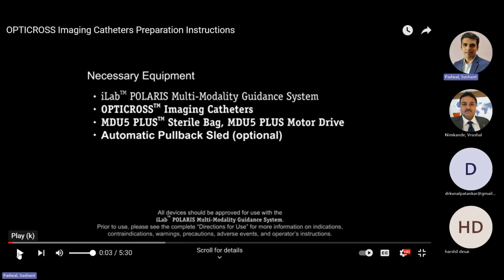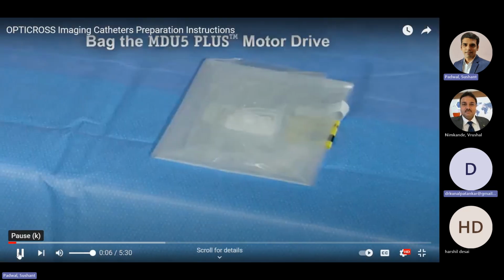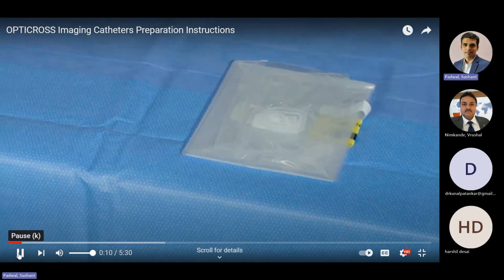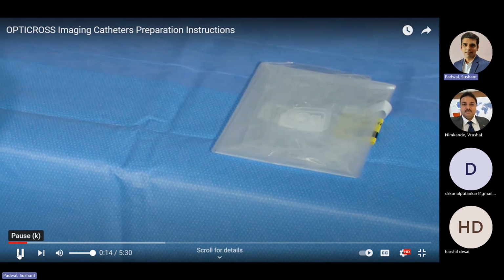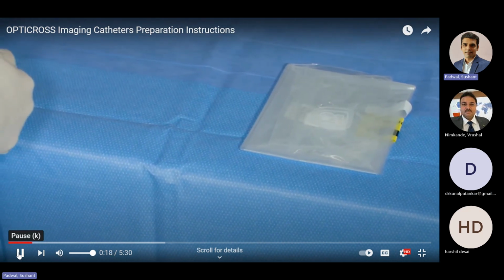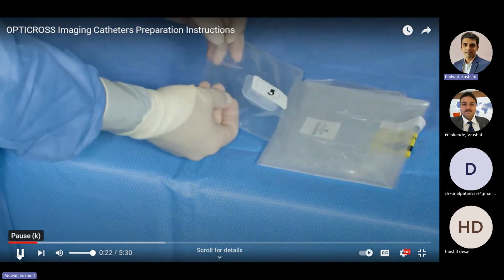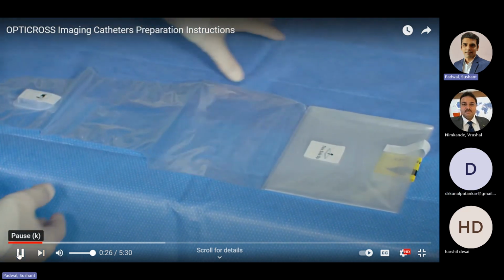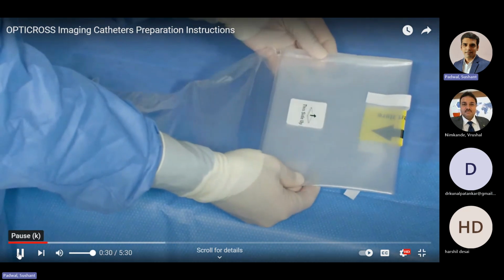To bag the MDU5 Plus motor drive, one sterile field operator and one non-sterile field operator are required. The MDU5 Plus sterile bag is located within the imaging catheter box and should be placed on the sterile field. The sterile field operator will unfold the bag with the faceplate on one end and the Insert Here sticker on the other.